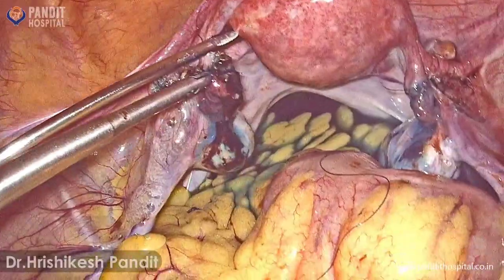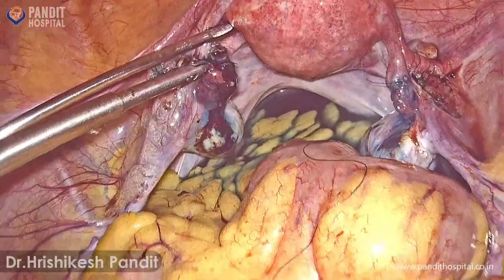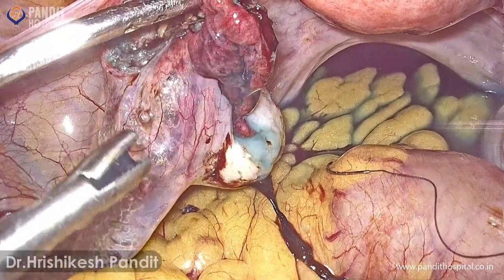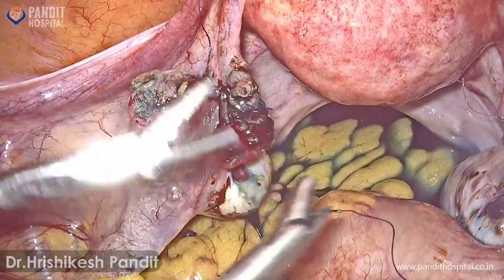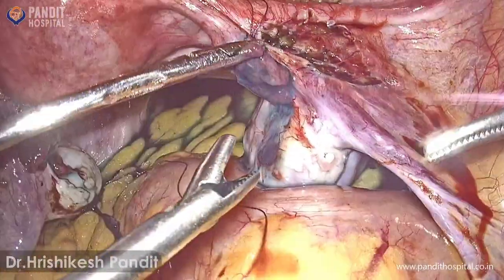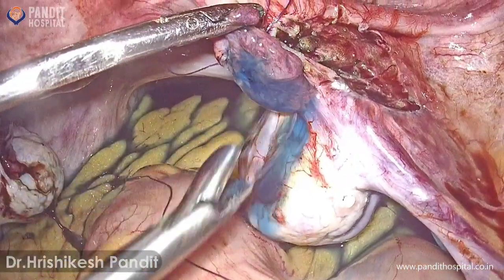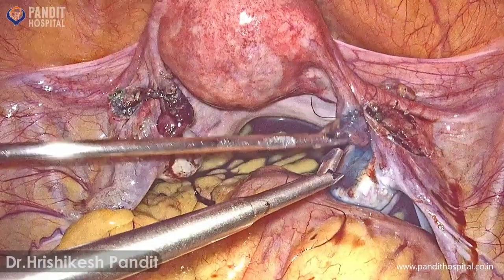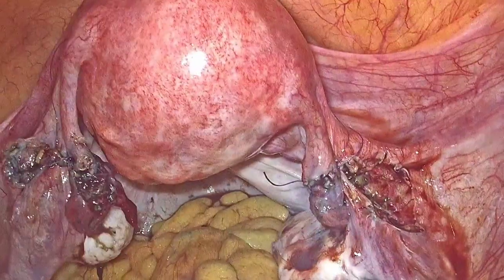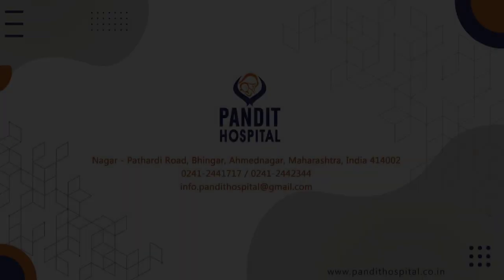There is free spillage without any leak from the anastomotic site. Methylene blue is freely coming from the fimbrial end — that confirms free spillage without any leak. Thank you.